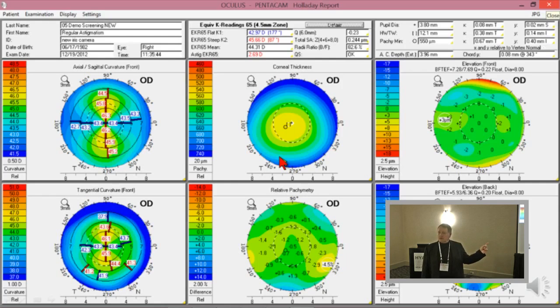And that's what we do. In other words, if you look at Koch's paper, it's in the reference at the end of those things. But the Zernike term is a sombrero, okay? And that's not really what you want. You really want the parabola. In other words, spherical aberration actually increases all the way out linearly. It doesn't come back down and go through zero. That's a result of Zernike's transformation.